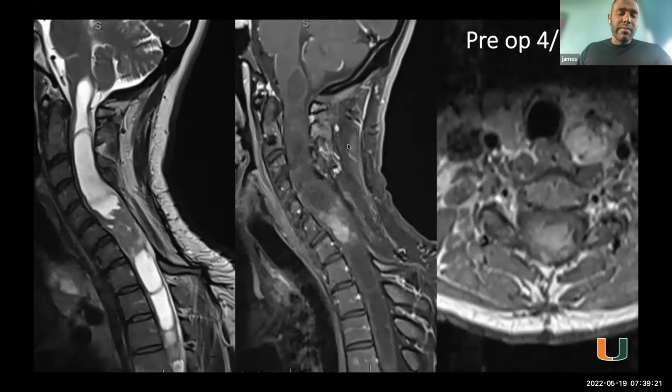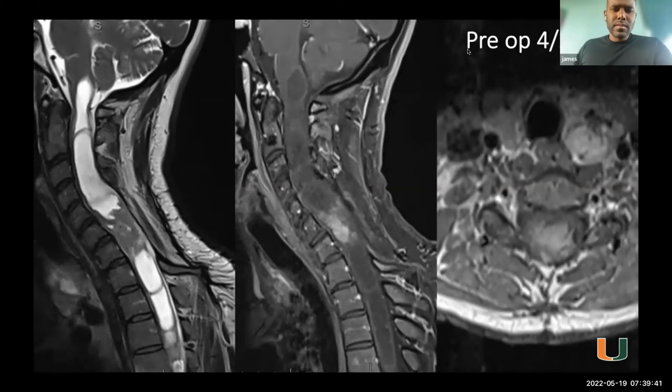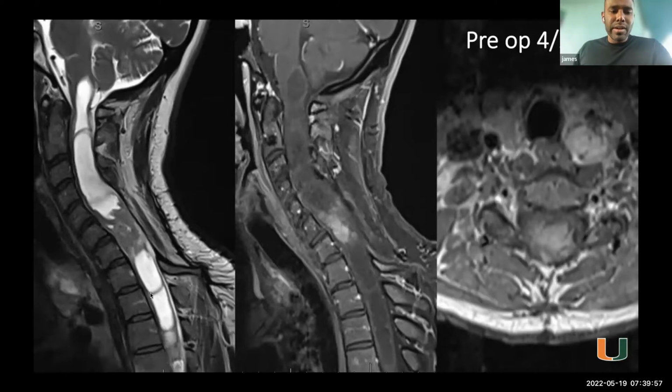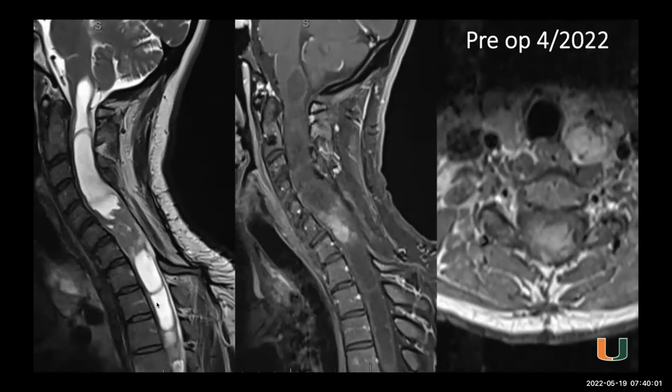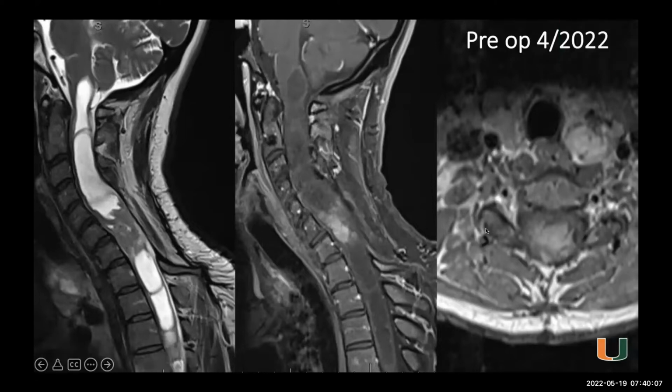Now in this case, obviously, I'm assuming your answer is going to be to re-image the patient after they've been lost to follow-up for all these years. And you get this. What do you see here? It looks like that intramedullary mass has gotten bigger, causing CSF flow obstruction at that level in the cervical spine, with a syrinx above and below the tumor. This thing that you keep calling a syrinx, do you know another name for it? No, I'm not sure. They're sometimes called polar cysts. Oh, gotcha. I see.